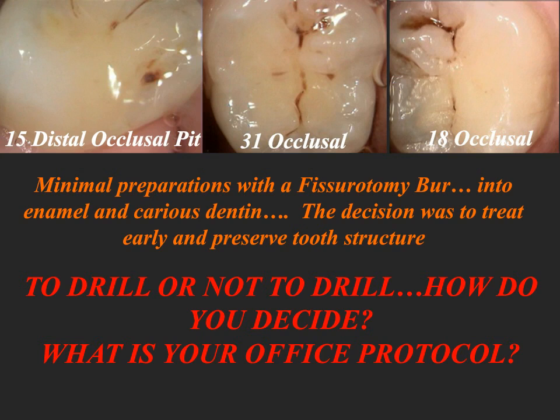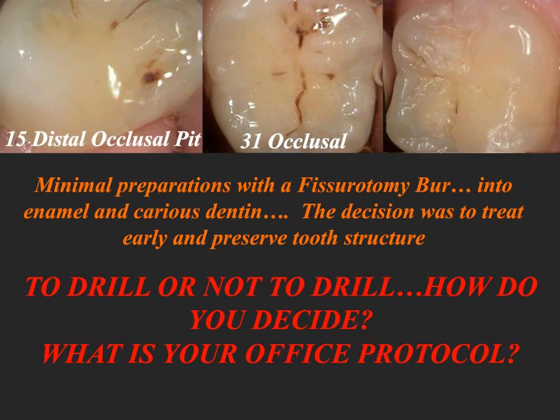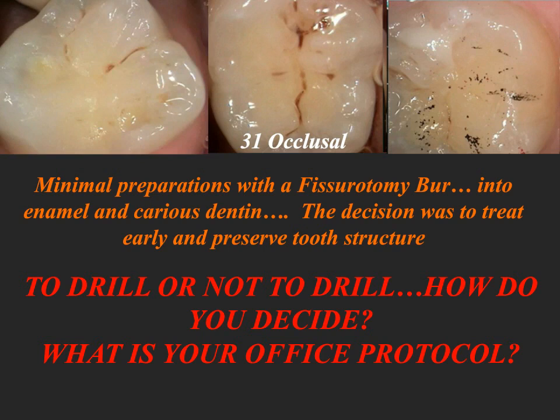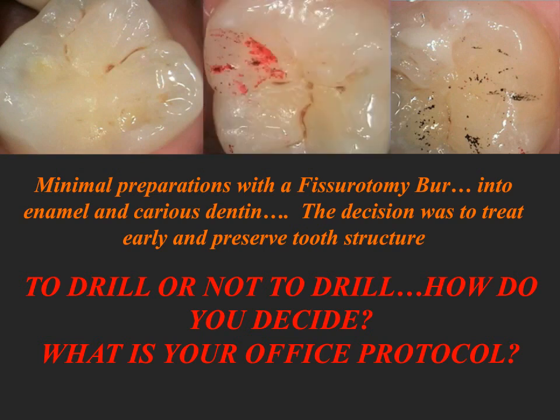To drill or not to drill? How do you decide? What's your office protocol? As I said, my decision here was to treat early and preserve tooth. Here you can see fissurotomy was done, teeth are restored, occlusion is checked. Really hard to see where the restoration is in the tooth. We'll get into this process in a lot more detail in following cases.